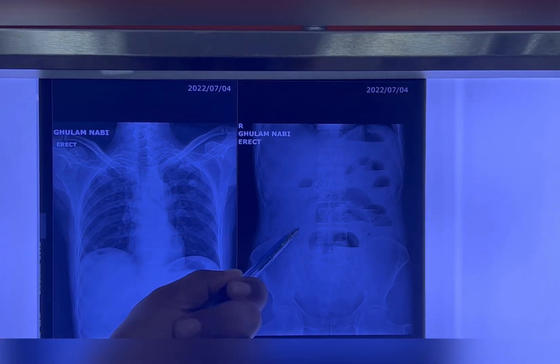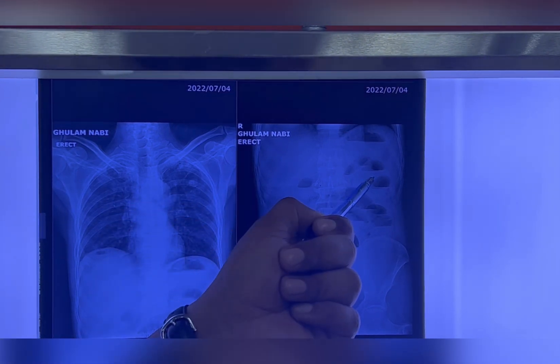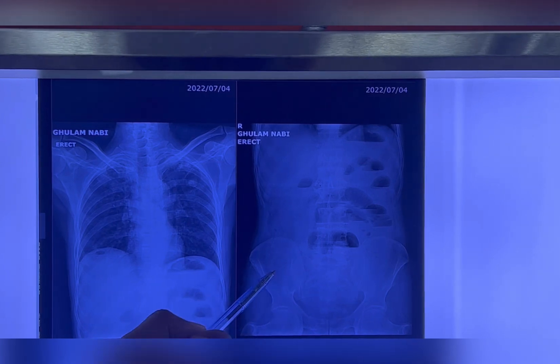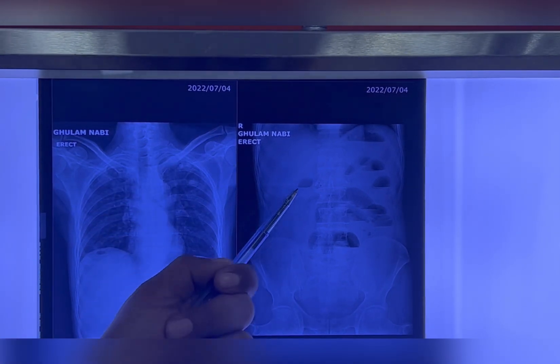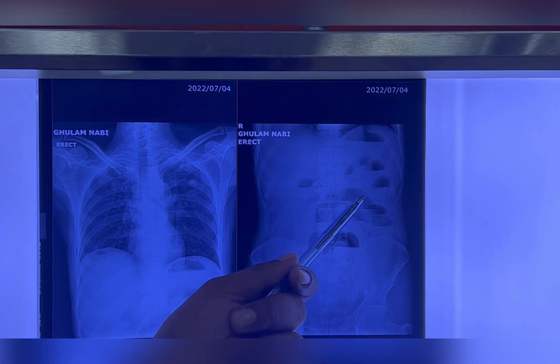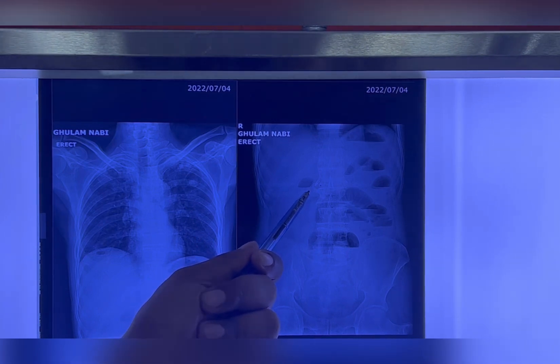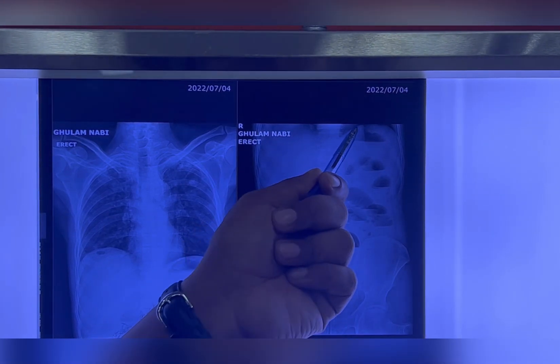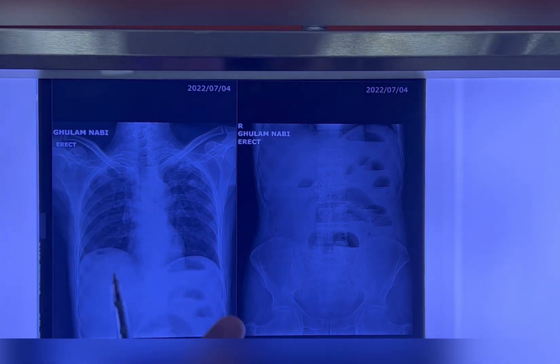This is the X-ray abdomen erect. We call it erect because this X-ray is showing multiple air fluid levels. Whenever you see multiple air fluid levels in the X-ray, it means that is an erect abdominal X-ray. Normally, we can see three air fluid levels in every X-ray which can be taken as normal — in the stomach, the duodenal cap, and the cecum. These three air fluid levels are normal in every abdominal X-ray; you cannot say this is a case of obstruction.